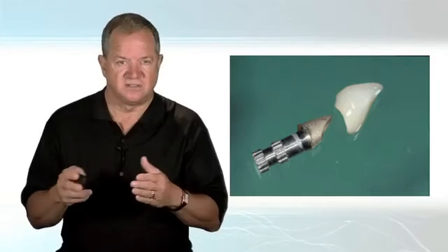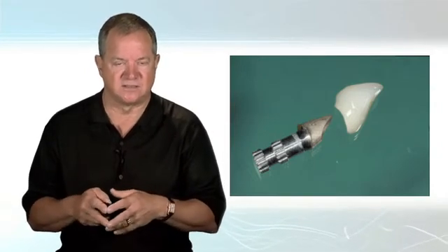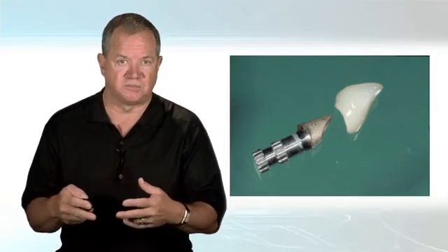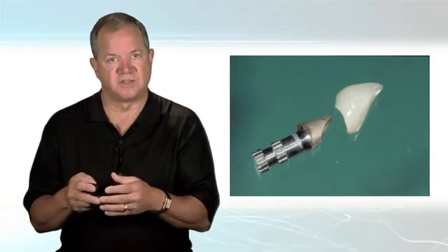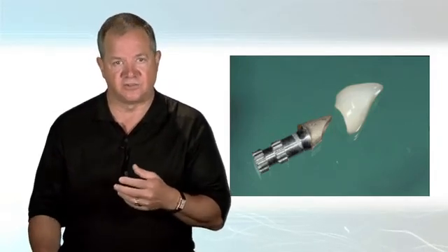In addition, some implant systems don't have zirconia abutments, and in those cases, if you use a gold-colored abutment or if you use a metal ceramic abutment and bake porcelain on it, you can make up for the lack of a zirconia abutment.